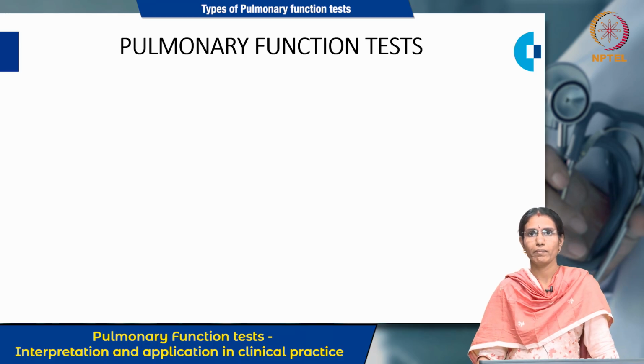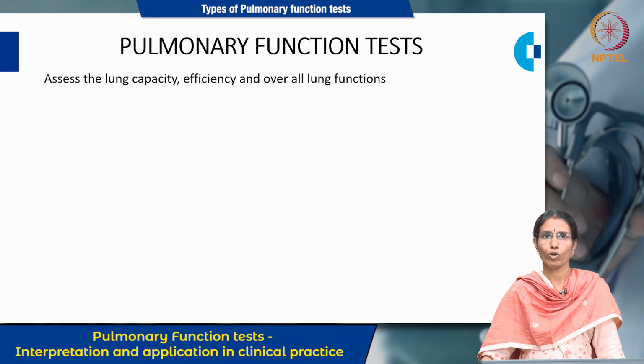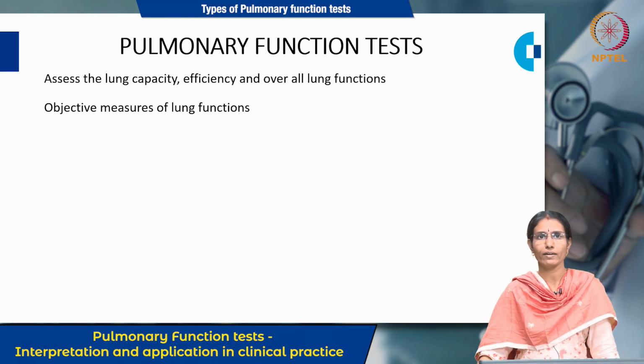In this module, we are going to see about the types of pulmonary function tests. What are pulmonary function tests? They are objective measures of lung functions. They assess the lung capacity, efficiency and the overall lung functions.